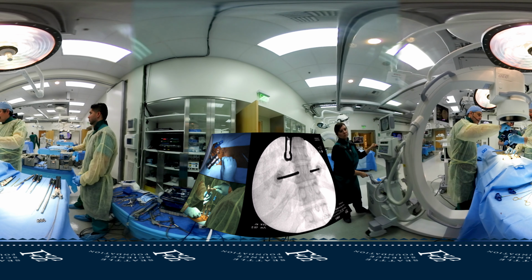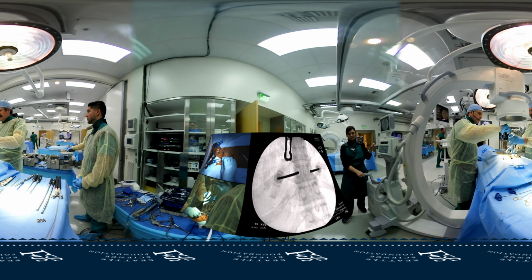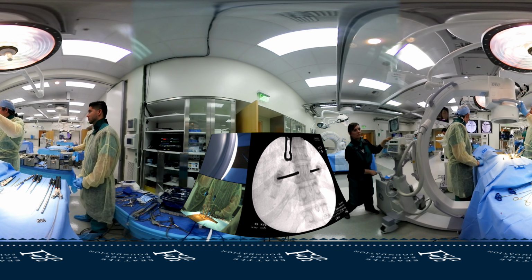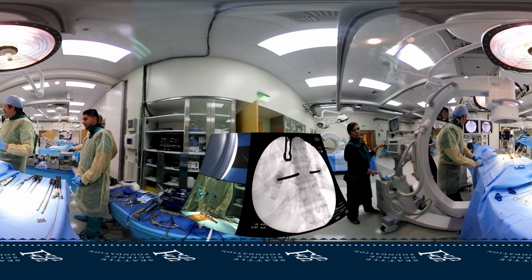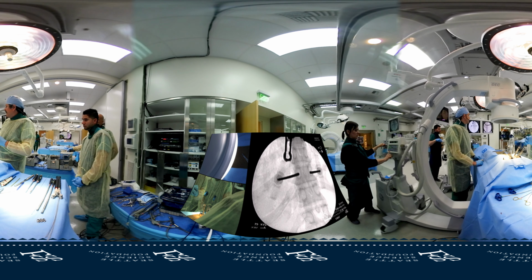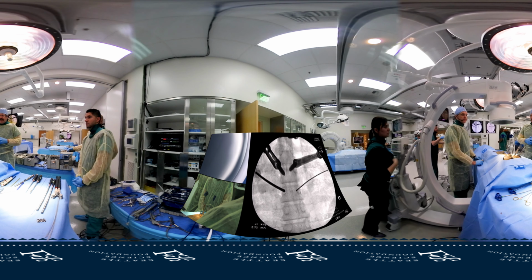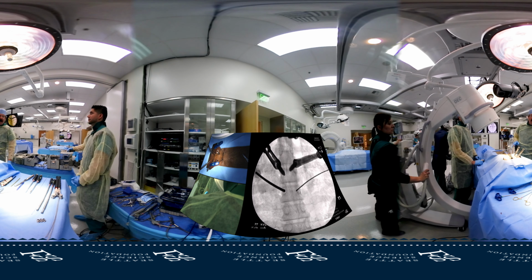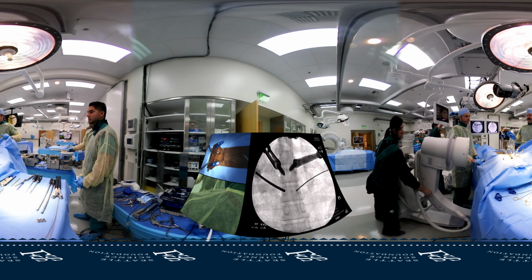I'm going to show you what it looks like when we cross the midpoint, because we did that on one of the screws that was already in there. Good. Come down. Picture. All right. So you can see I've not crossed the medial border of the pedicle. So I'll move that image left to right, so I can still look at it and come to the lateral now. So based on my estimates, I should have the tips of these roughly at the back of the vertebral body or just inside the body. And if that's the case, I'm very safe.